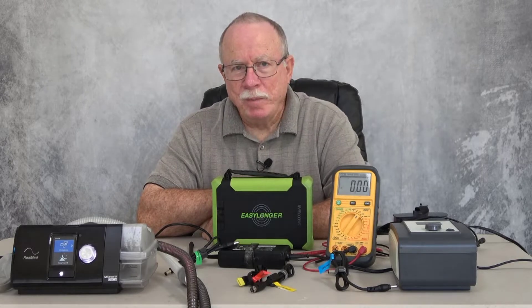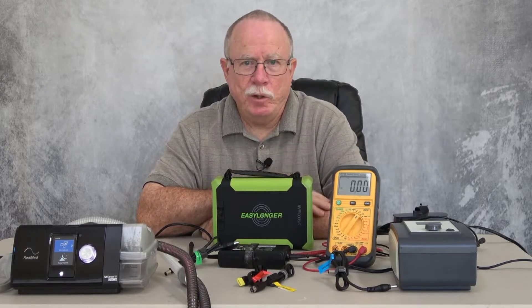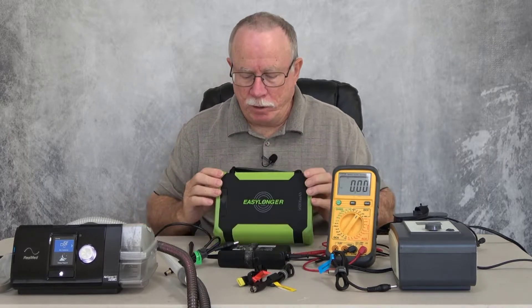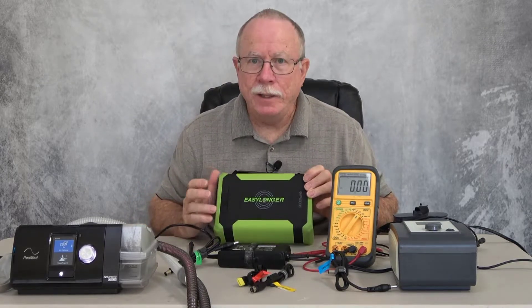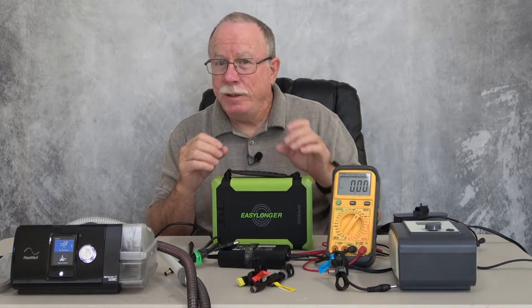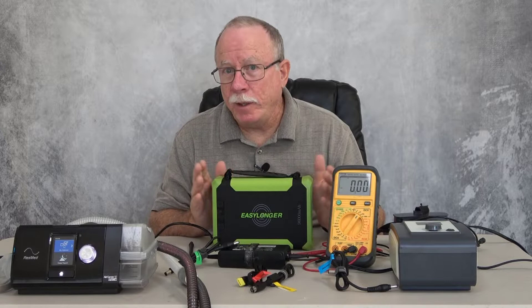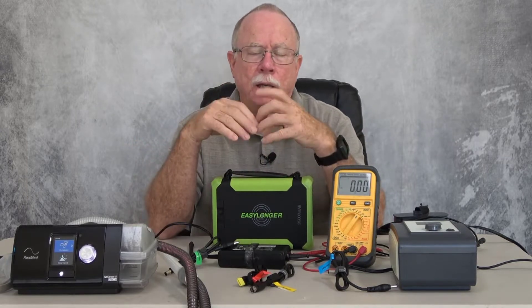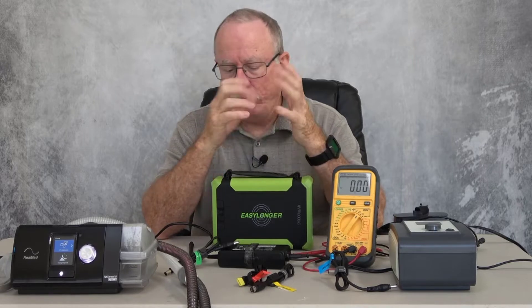Hello, I'm Jim Brewer, and this is part two of our video on the EZLonger ES960 battery that's really designed to operate CPAP machines, but it could be used for a wide variety of electronics and so forth.